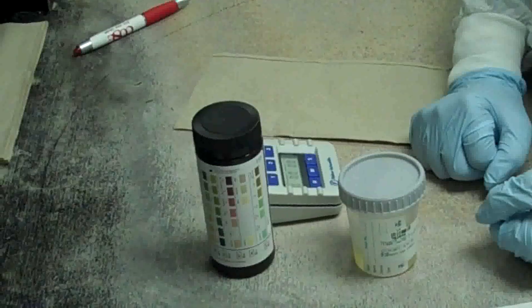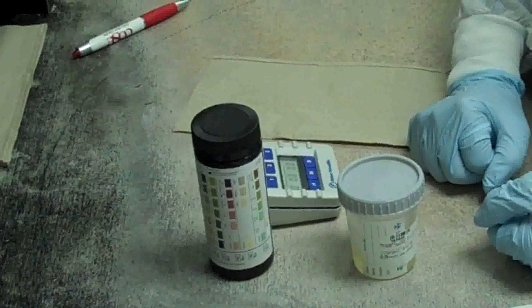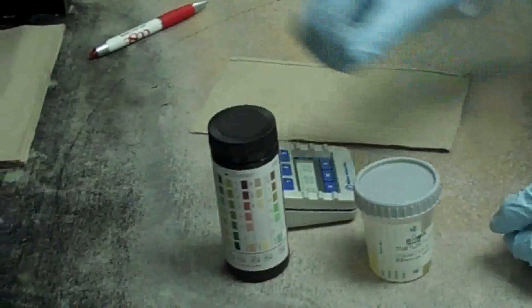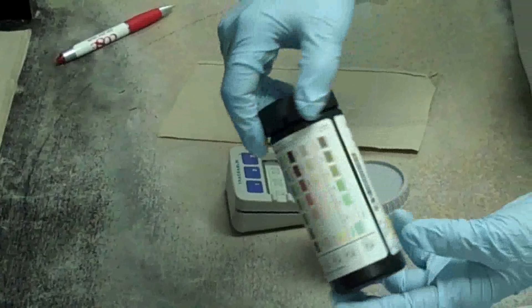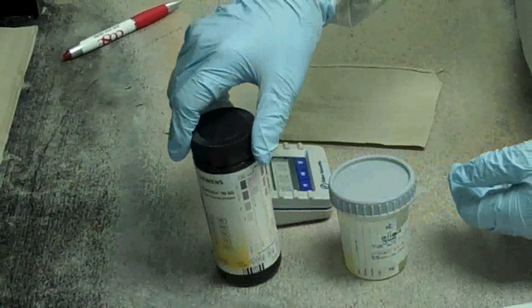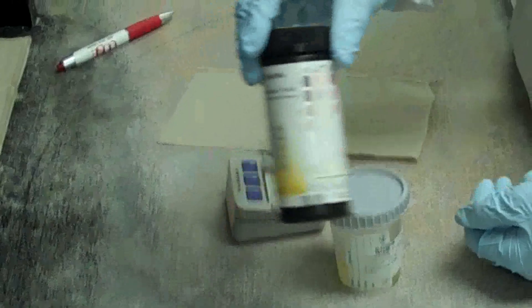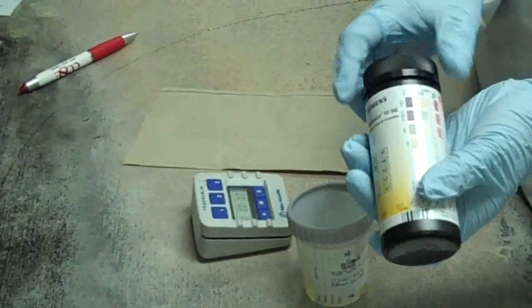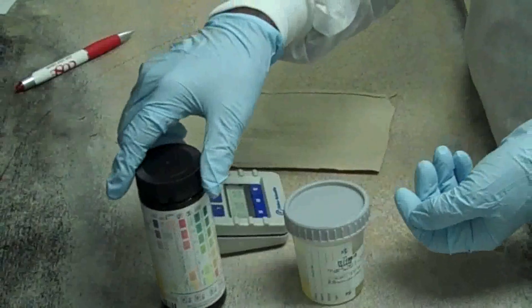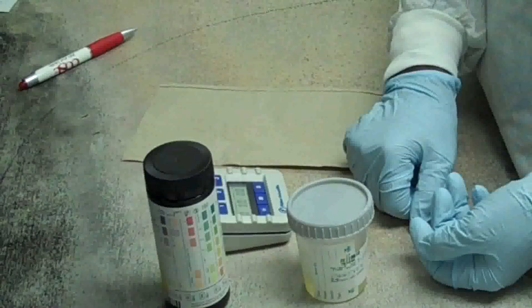Store MaltiStix urinalysis strip at room temperature in the original bottle only. Do not remove desiccants from the bottle. The desiccant is the drying agent inside the bottle. Do not use reagent strips beyond the expiration date.